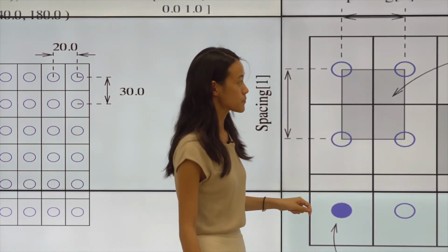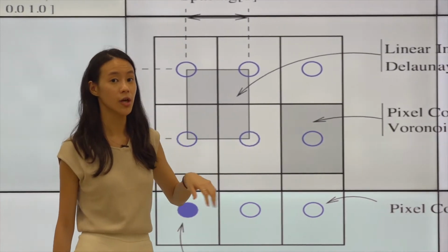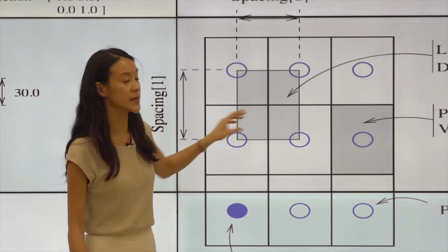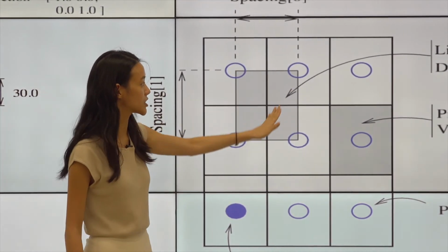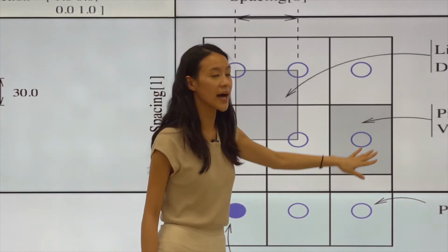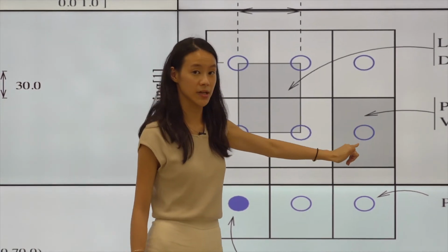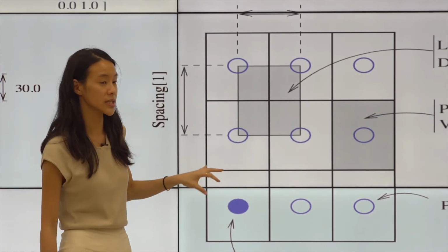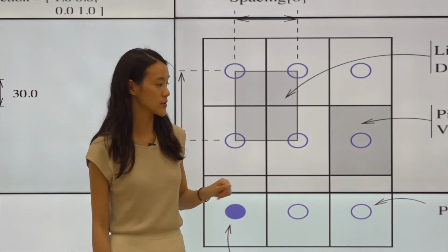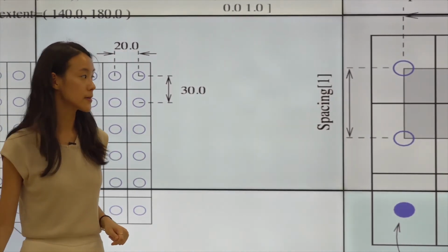And so one thing to note is that when we're talking about interpolation, what usually happens is in the region of the pixel region. So what we're talking about is in between each of these things. For the pixel coverage, a lot of times it's the entire pixel. So the boxes that we see are pixels, and these are pixel centers. But when we're talking about interpolation, it is in the spacing between the 4 neighboring pixels, or the 4 neighboring pixel coordinates or origins that we will be seeing.